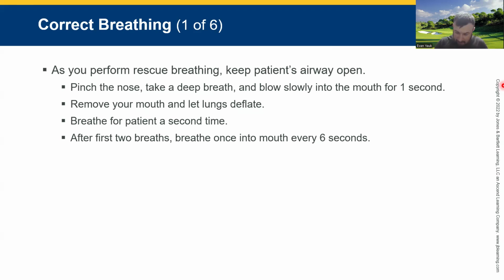While we're giving that breath, you need to have your eyes looking down that patient and watch that chest rise. We don't want to blow them up like a balloon. It's 1 second. That's it. Make sure that chest rises. If the chest doesn't rise, let's reposition and make sure that airway is open.